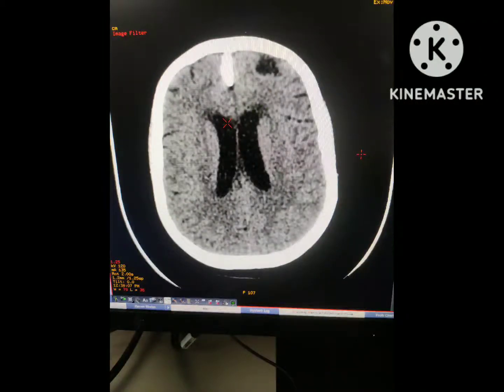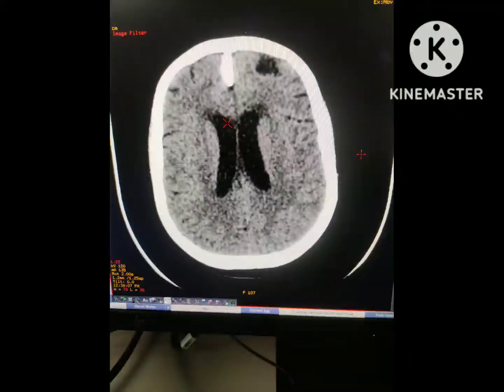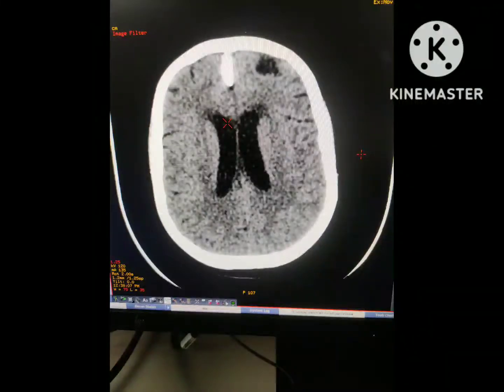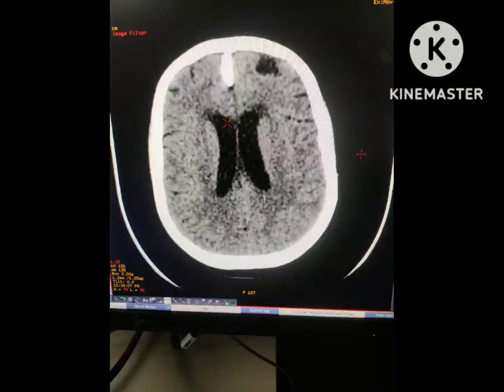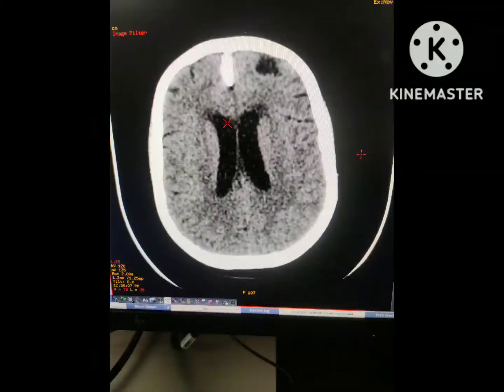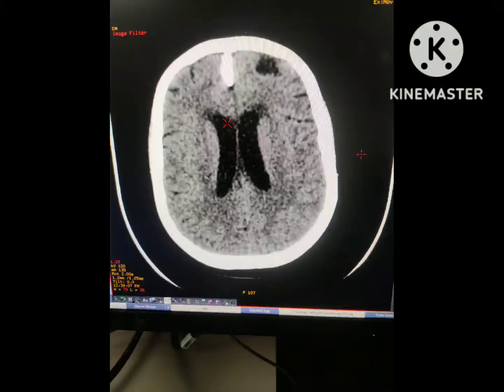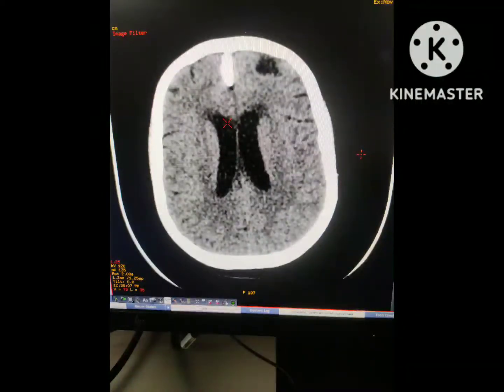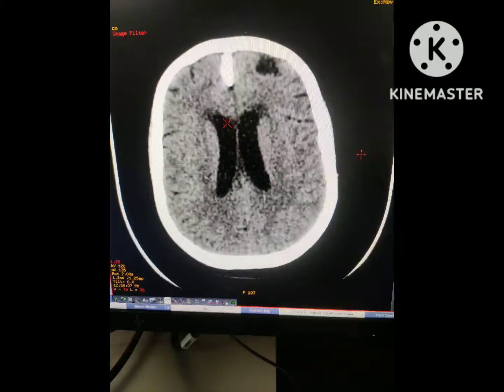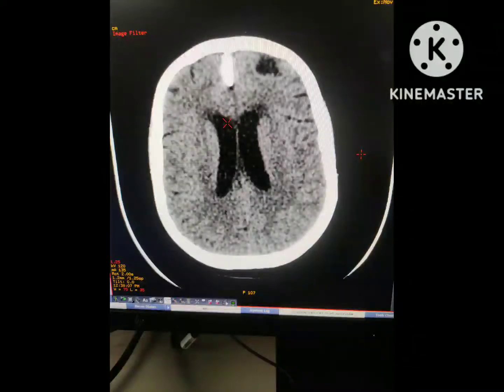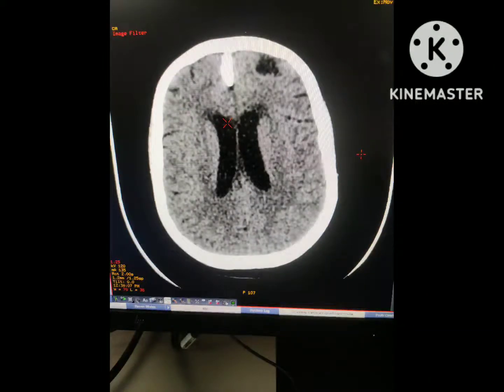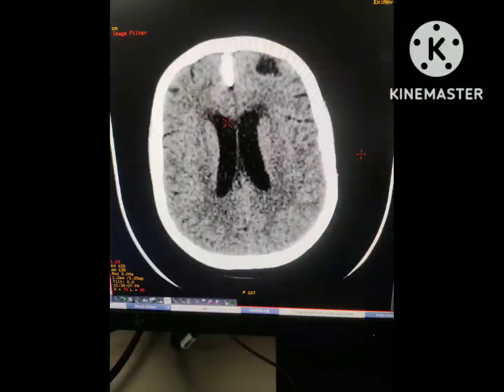Although falx calcification is a common finding, its prevalence and incidence is higher in case of endocrine disorders. It is more commonly found in cases of basal cell nevus syndrome and myotonic dystrophy. So this is all about falx calcification.